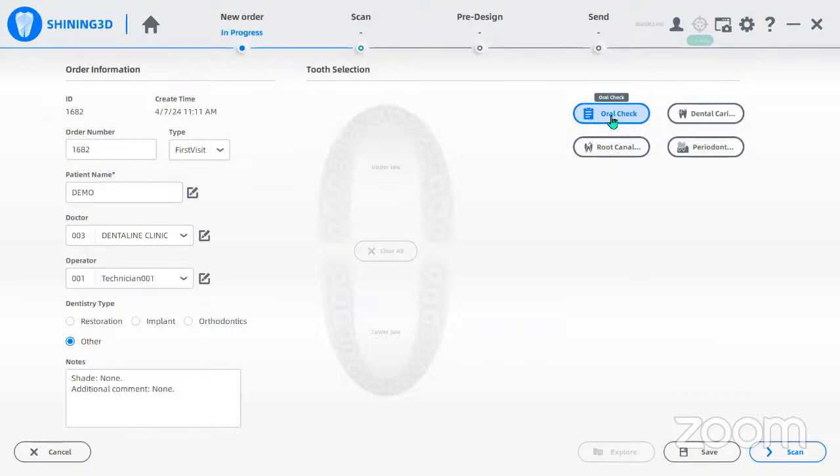Today, with the technology that we have, we can use an intraoral scanner as an intraoral camera. We can also use it for caries detection. That's possible because of the type of light it reflects. We can measure early dental decay and give a report regarding this. So this can be recorded and sent over to the patient. So many of these things are possible today.